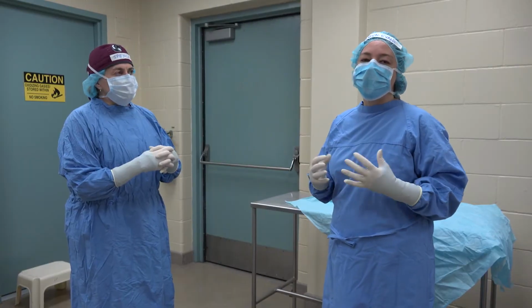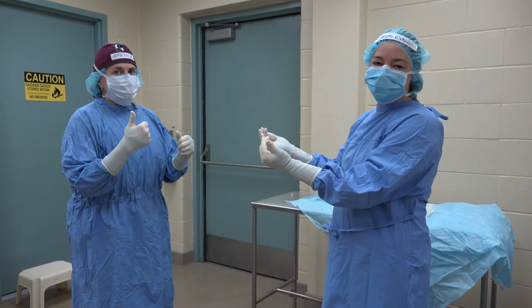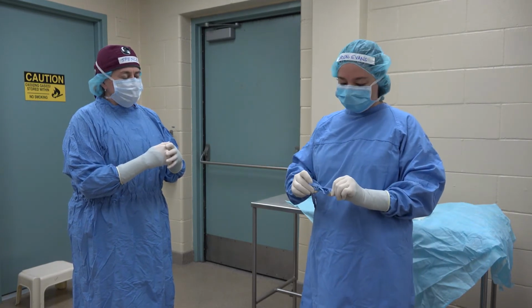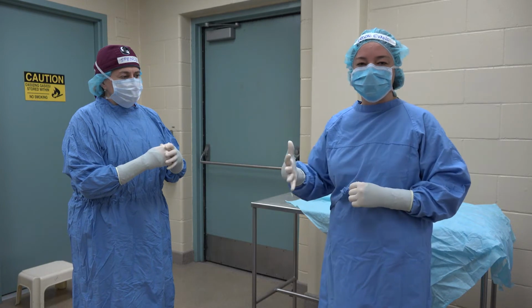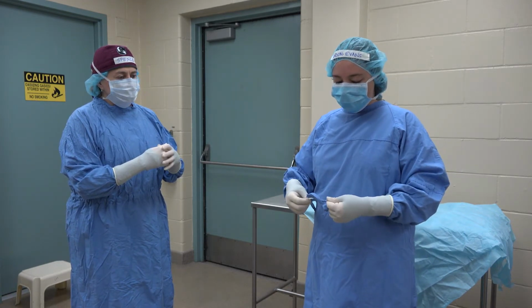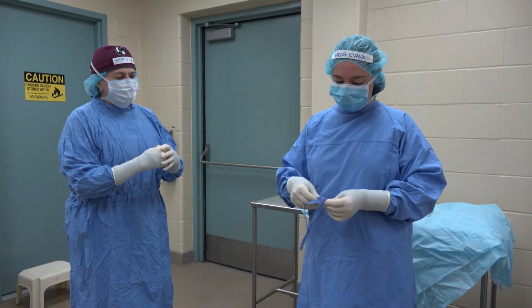All right, guys, now I'm all gowned, and my friend here, Dr. Spence, is all gowned, my assistant. And so now I have this little guy that I have to take care of so that I actually can cover up my backside and be a little bit more aseptic and less likely to contaminate things. Okay, so what I'm going to do is hold both strands and untie the bow.